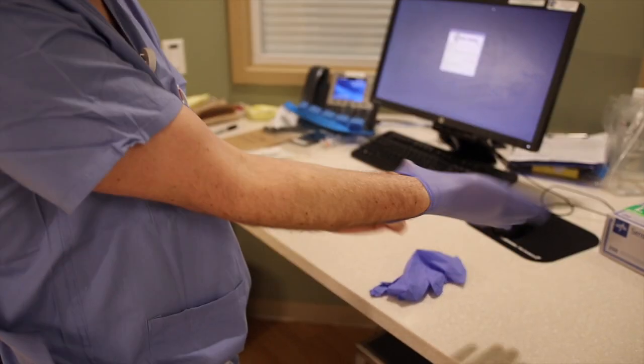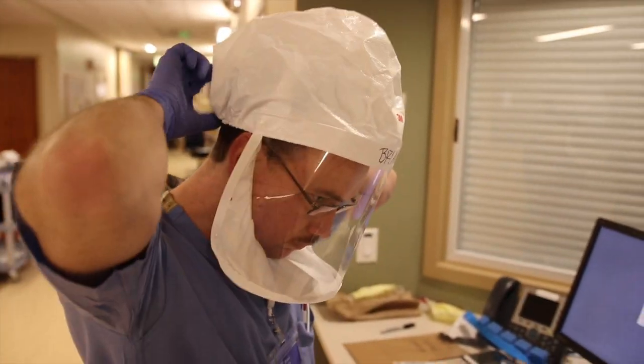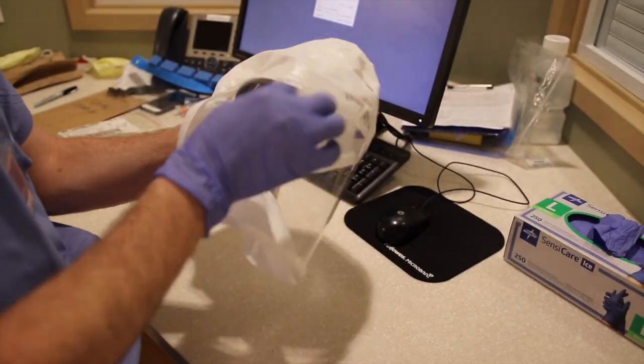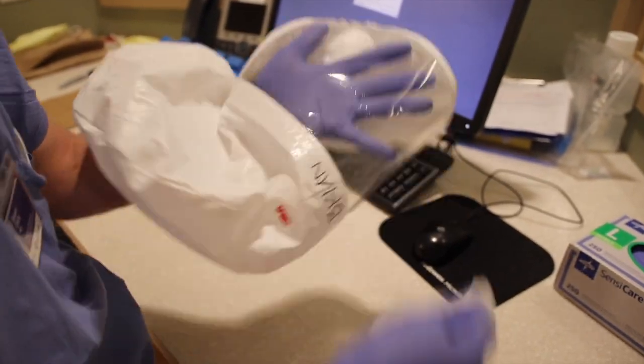Outside the room, you will don a second set of gloves to remove and sanitize your equipment. Start by detaching the hood from the PPE unit itself, remove the hood from the back, similar to the face shields, and then wash the hood thoroughly using sanitizing wipes. This hood will be yours for use in multiple patient rooms, so please ensure that you sanitize it thoroughly before setting it aside.